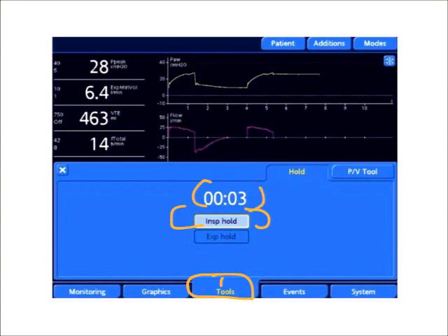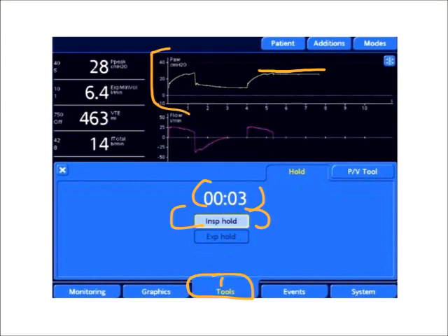The inspiratory hold allows me to hold the inspiratory portion of the breath, and as you start to notice it here, it's starting to lengthen it out in my pressure waveform.